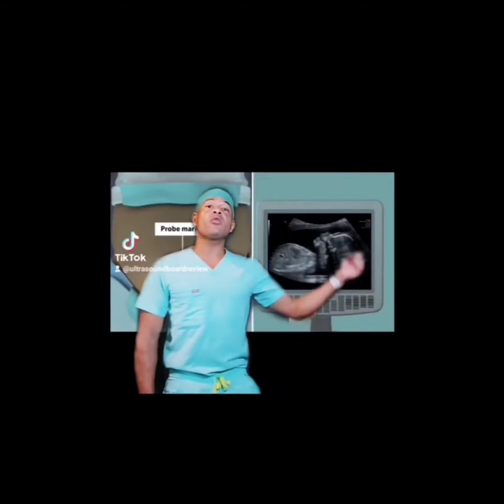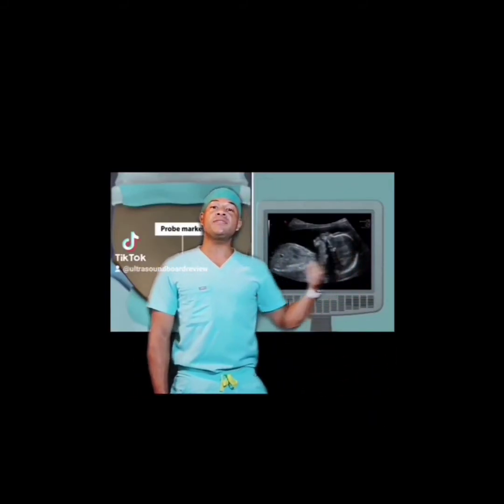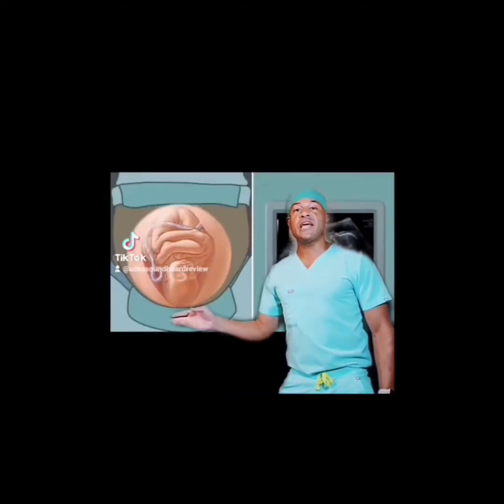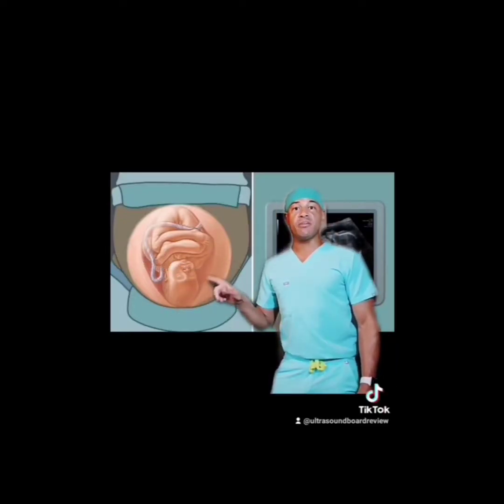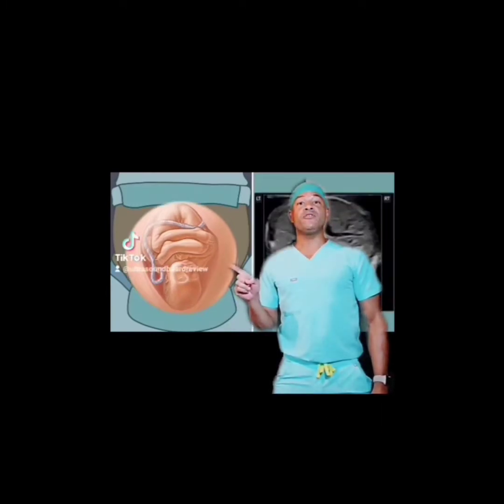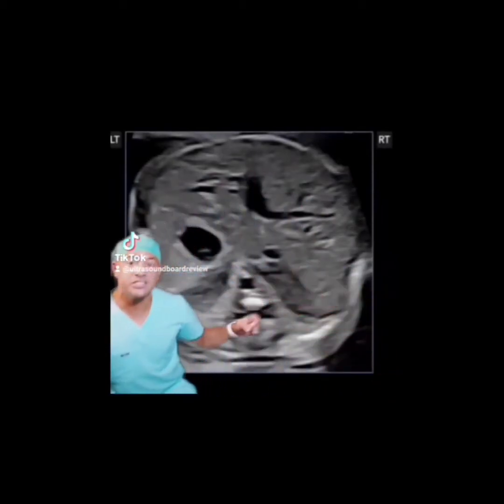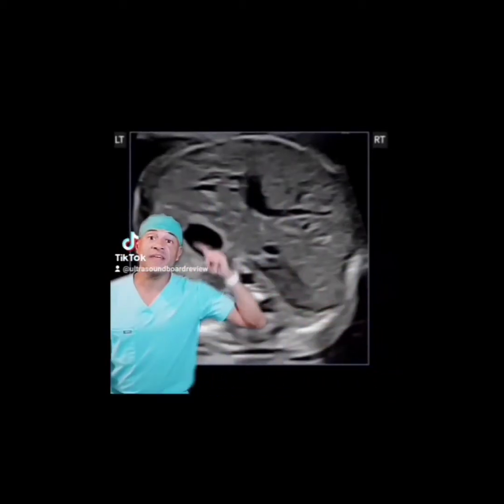Now, because the baby's head is on the right side of the screen and the feet are pointed towards the left side of the screen, that means that this baby must be in the cephalic presentation. More specifically, this is the supine cephalic presentation. So the posterior side of the baby is down while the anterior side of the baby is up. If you were to obtain an axial view of the abdomen at the stomach level, you would see the spine at 6 o'clock and the stomach at 9 o'clock, which is the left side of the baby.